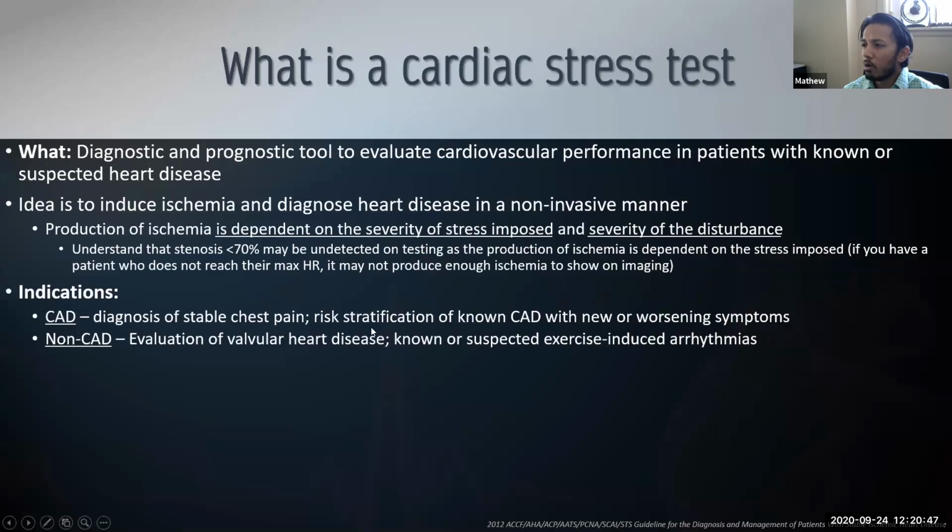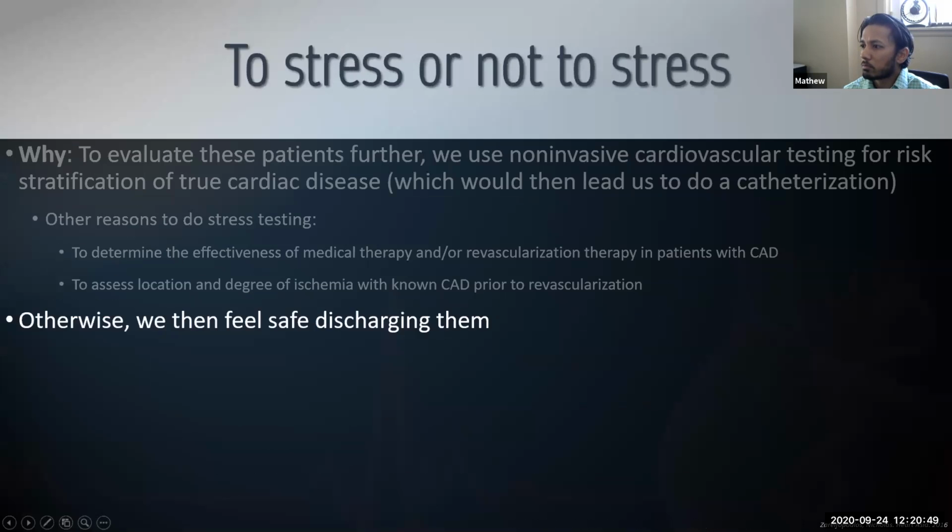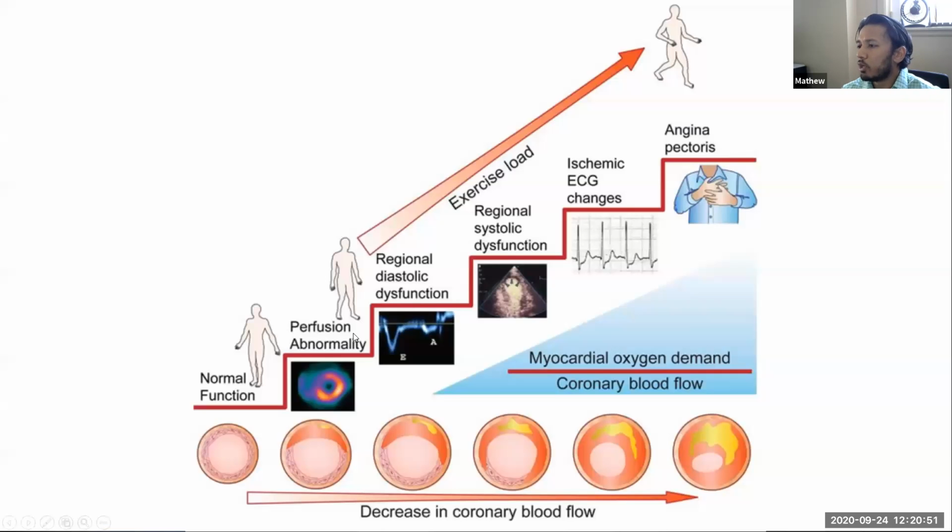Okay, so let's go back. As we go along, we can start seeing more echo findings here. And then finally, once the plaque gets really bad, that's where we're actually going to start seeing EKG findings. Don't think that because of this chart, you would not want to do EKGs beforehand. You still want to do those, right? But what I'm saying is when the patient presents without you inducing a stress on them, that's when you're going to start seeing some of these EKG findings come up.